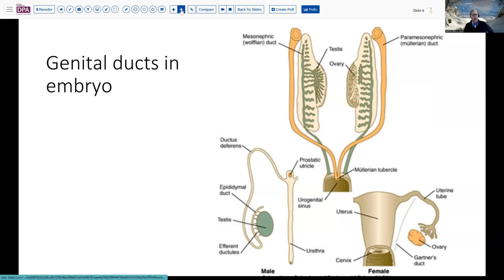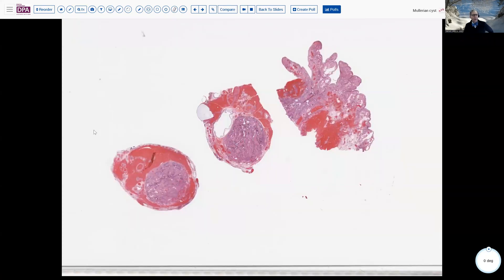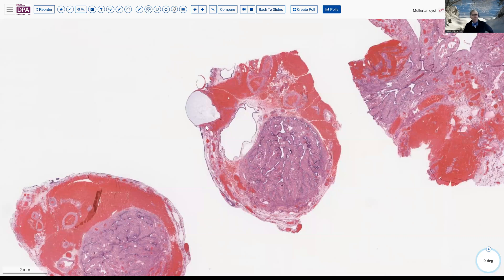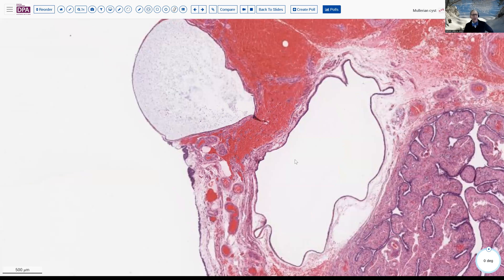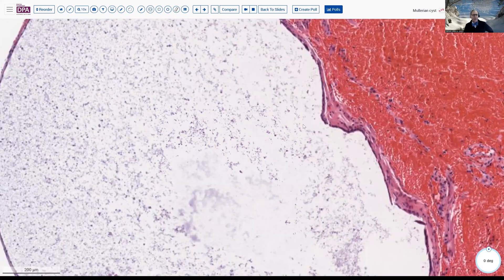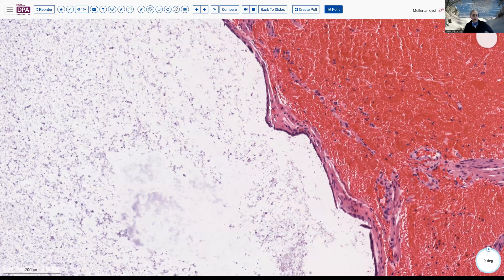These two systems develop in utero in parallel, and then depending on the hormonal situation, evolve in one direction or another. Here's a nice example of a fallopian tube. We see the dilated, somewhat edematous fimbria, the tube with associated paratubal hemorrhage, either surgical or otherwise. Right here we can see two or three nice cystic lesions, and even at this magnification we can perceive that these are very thin-walled cysts, separate from the tube — truly paratubal cysts. There is virtually no associated connective tissue; these are just epithelial-lined cysts.